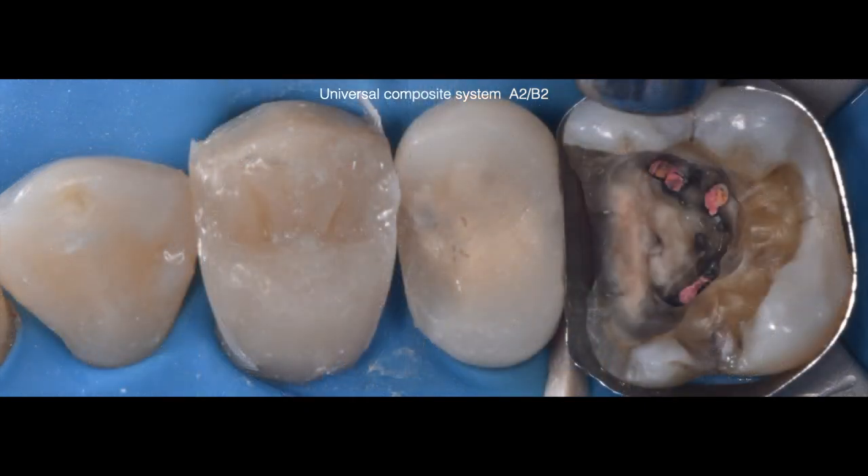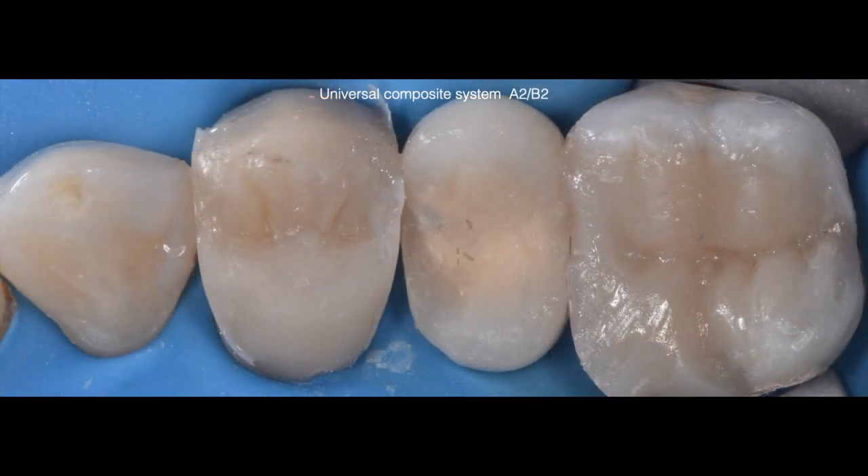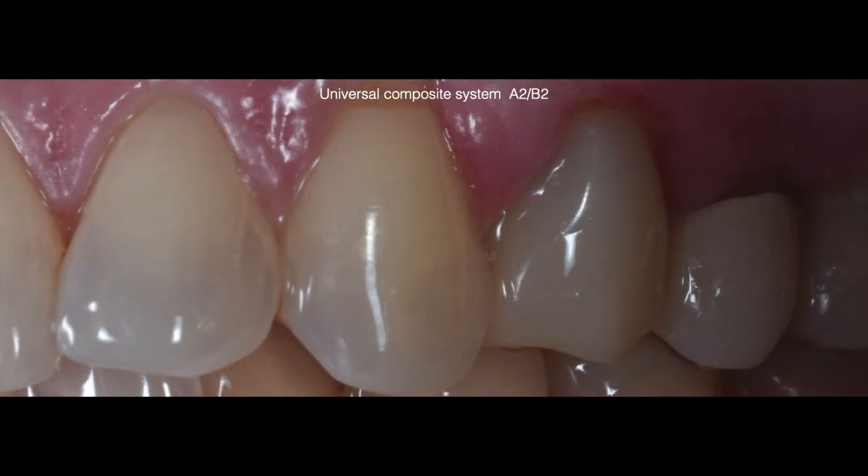Once we completed tooth number 12, we initiated restoration of tooth number 14. The first step was deep margin elevation using resin modified glass ionomer, followed by adding Brilliant Everglow A2B2 until all contours were restored. Here is the photo after occlusal adjustment and polishing using the Shapeguard system by Coltene. The restorations have the right opacity even though for tooth number 12 it is a full crown that was restored. On this side view of tooth number 12, look at the dentin-like opacity that mimics the surrounding natural dentition.